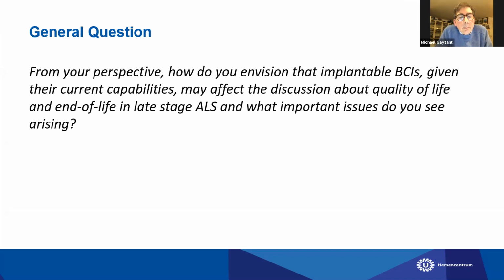For what we know, many patients with ALS will lose their ability of speech, and especially in the case of such a devastating disease like ALS, with all the emotional burden for the patients as well as for their loved ones, communication will be essential. And nowadays there are alternatives for speech, like a speech computer, or in a later stage, solutions which can convert eye movements into speech, which are the only available techniques. But if these techniques are not useful anymore due to progression of the disease or due to comorbidity, then I think BCIs can be a solution.